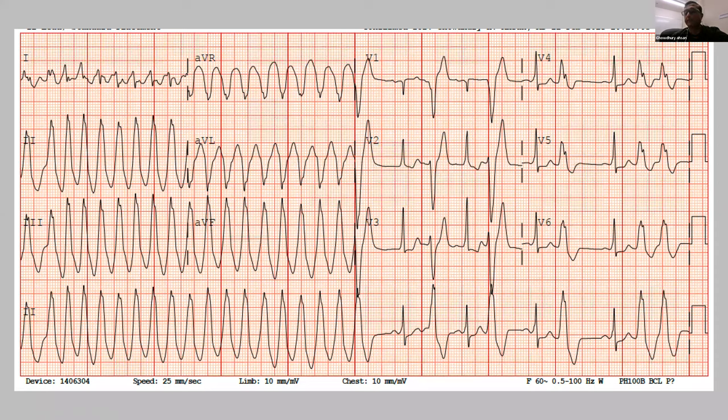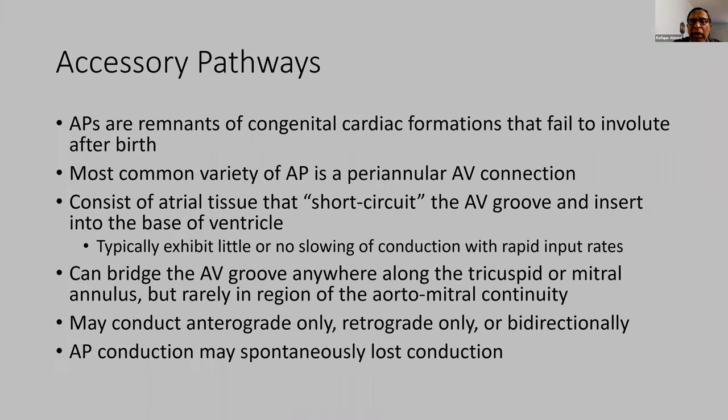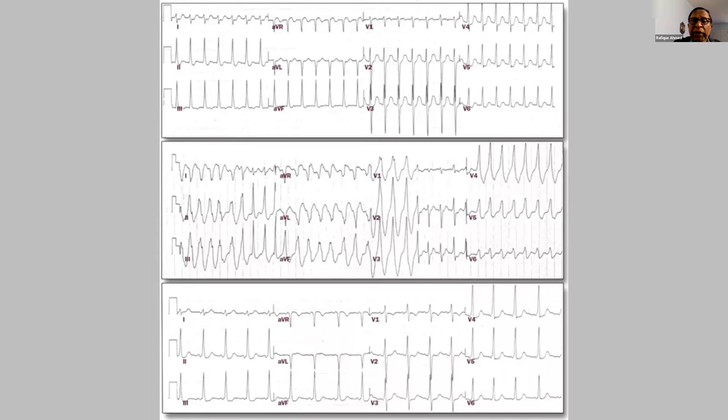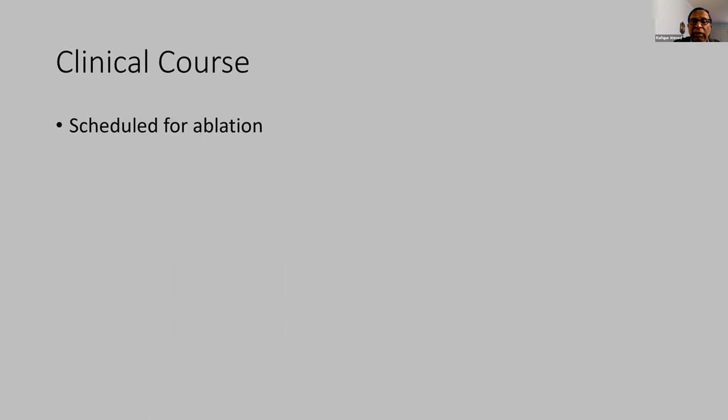One of our EP physicians still does not think that this is WPW alone. He accepts WPW, but he thinks there is a VT as well, Rafique bhai. Yeah, it's a little bit puzzling. I'll tell you why. If we look at lead V1, the first bit is not. Can you go back, please?